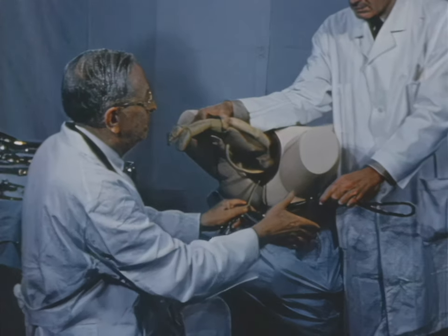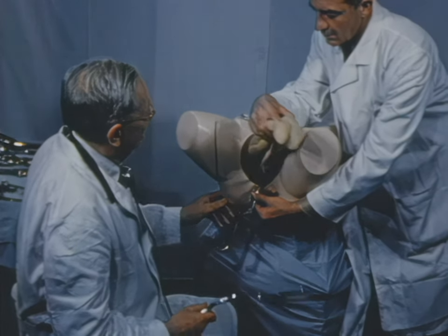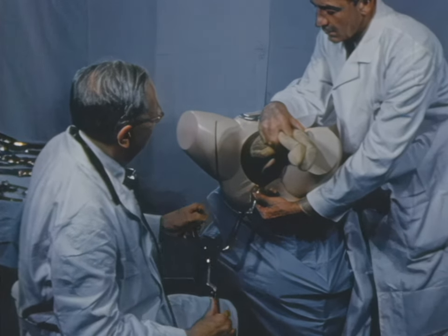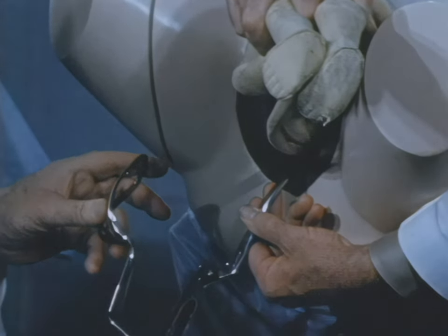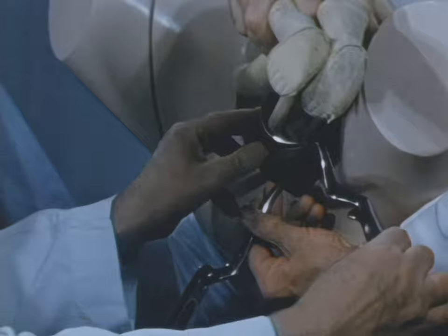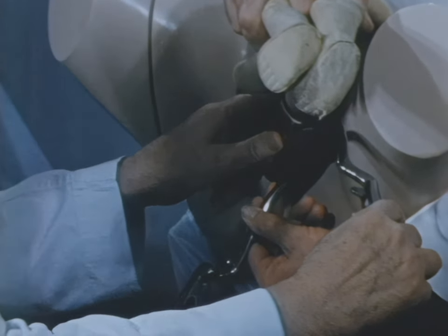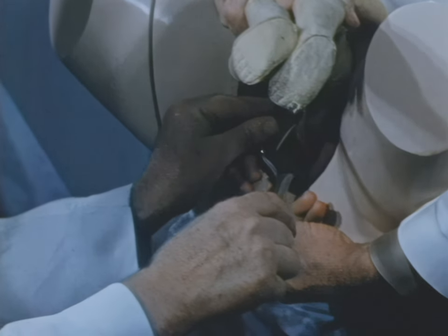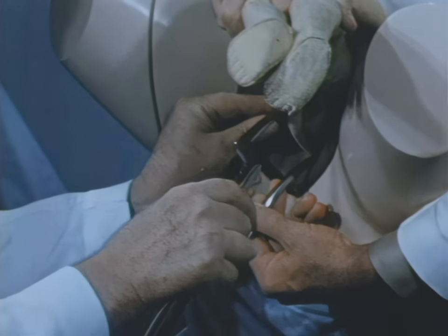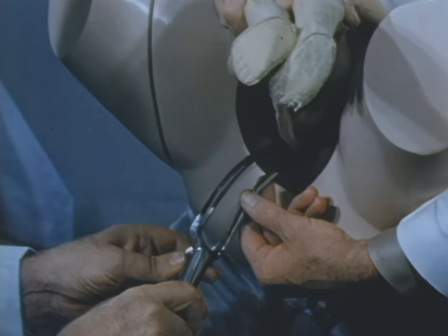Once in place, the assistant carries the body to the opposite side, exposing the approach to the right side of the patient, with the introduction of the right blade, the handle held near the left side and carried inward. Brought around to the midline and dropped into locking position.